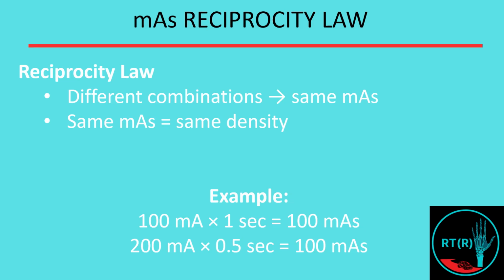The mAs reciprocity law: different combinations, same mAs. Same mAs, same density. You can adjust the mA and time while keeping mAs constant. This is important clinically, especially to reduce motion by using shorter exposure times.